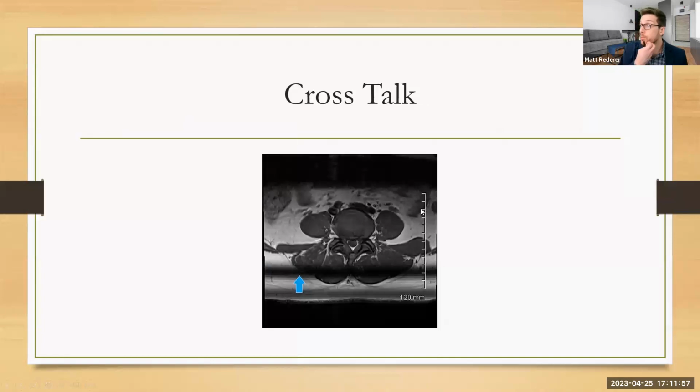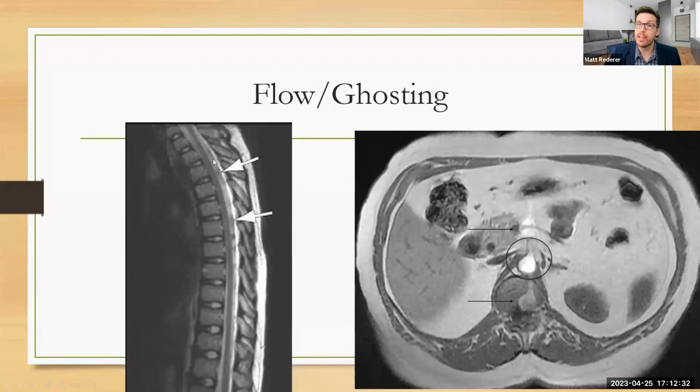This is something that we're going to talk about a little more next week, crosstalk. Crosstalk is very common in the lumbar spine. Anytime that you have slices that are overlapping, you get this type of artifact. Let's see here. This is caused because of movement. Correct. Diana, that's correct. It's caused from movement of something. It's not really the patient. They have no control over that. It's their vascular system moving blood through their vessels, or it's flow down their cerebrospinal canal. But you're right. This last one here is kind of involuntary motion that we get in our image.